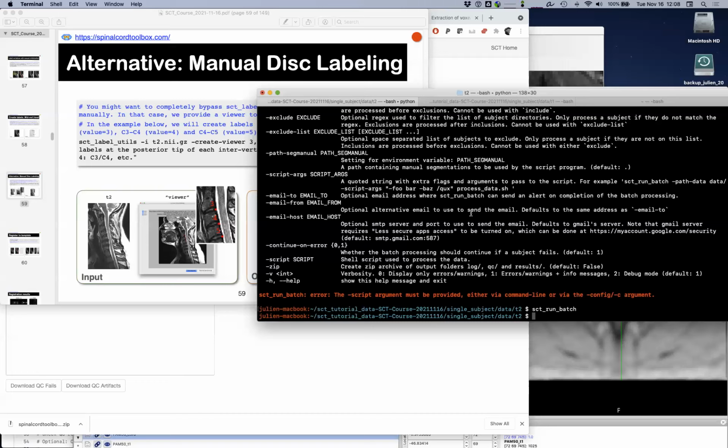In that case, I would recommend to use more than 2 labels, right? Now there is a con in using more than 2 labels. If you use more than 2 labels, then the upper part of the label and the lower part of the label will be chopped off in the registration, which is why currently we don't, by default, use more than 2 labels. Why is this chopped off? Because it's easy to compute an affine registration between 2 values, but if you have more than 2 values, then it's no more affine, right?